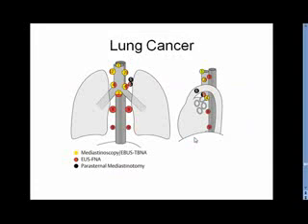Lung cancer is a very important and unfortunately still emerging field for endoscopic ultrasound. We are able to obtain biopsies, first to diagnose lung cancer and secondly to stage it. We don't have enough time to go too much into detail, but suffice it to say that endoscopic ultrasound is a preferred modality for subcarinal lymph nodes, area 8 lymph nodes, here paraesophageal, and area 9 lymph nodes.